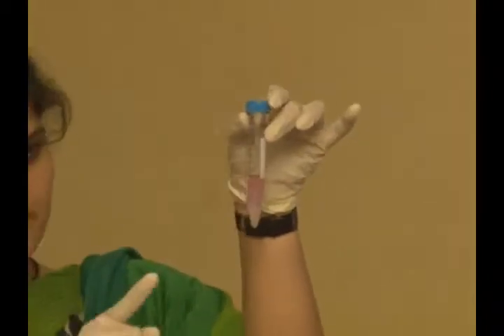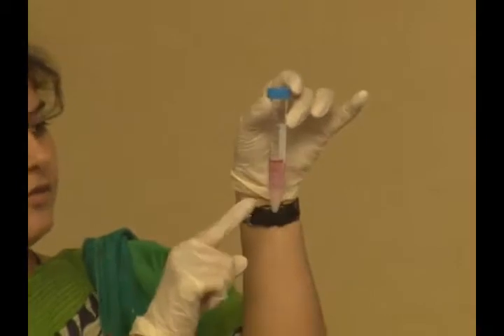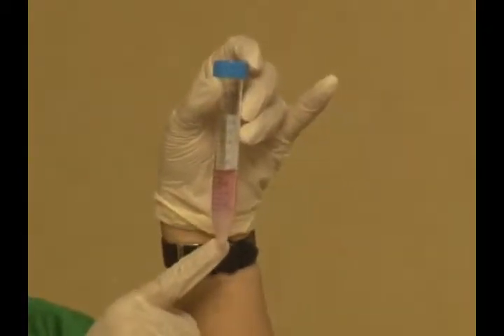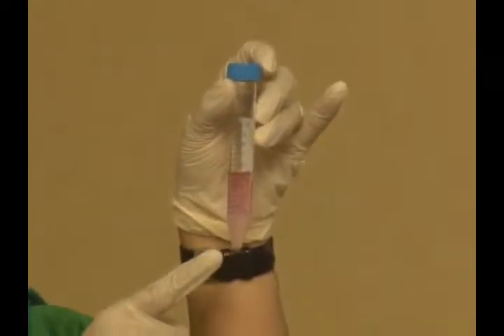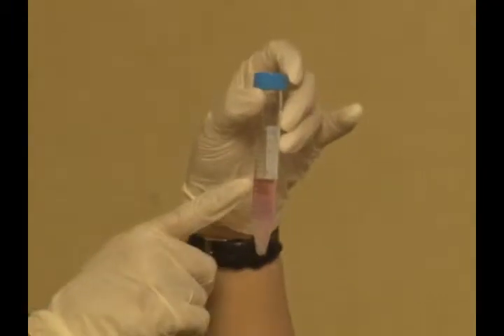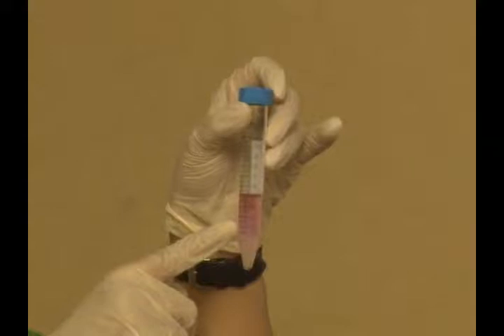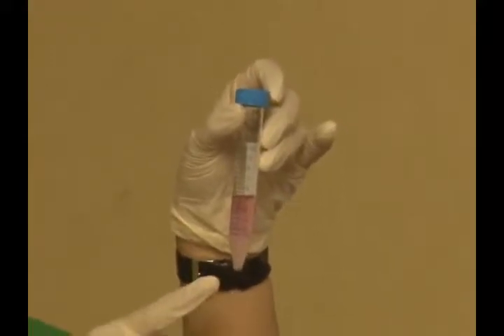Because of the interface, all the abnormal sperms, debris or pus cells will stick here, and whatever you get at the bottom is a pellet of concentrated normal motile sperms. So there are 3 layers again. This is the seminal fluid here, then here you will get the debris, and at the bottom you will get the pellet of the motile sperms.